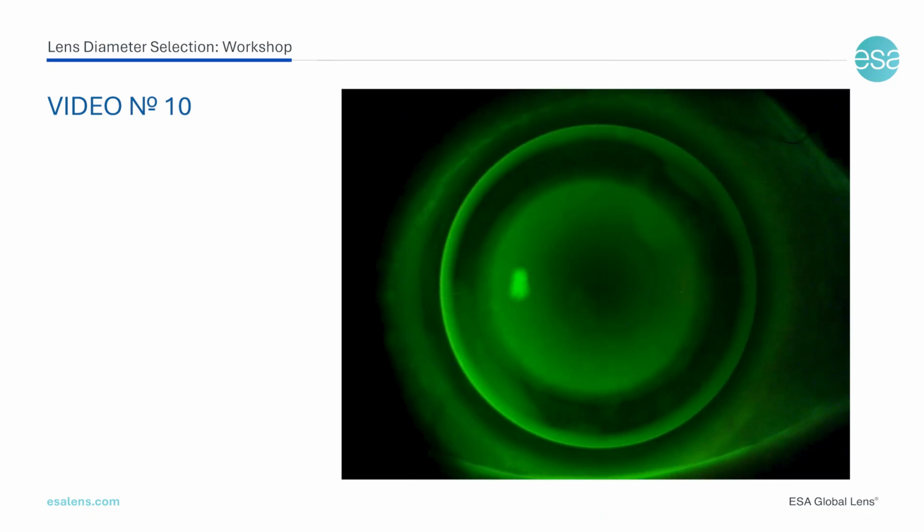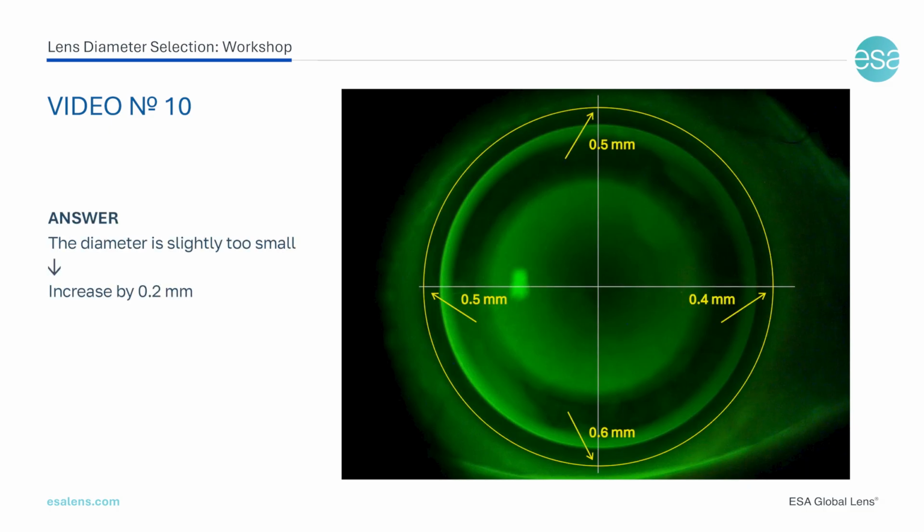What do you think of the diameter of this lens? What is your proposed action? In this case, the diameter is slightly too small, and we should increase it by 0.2 mm. This is a rare case.